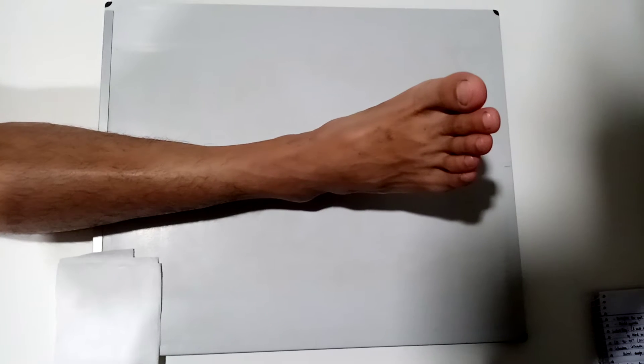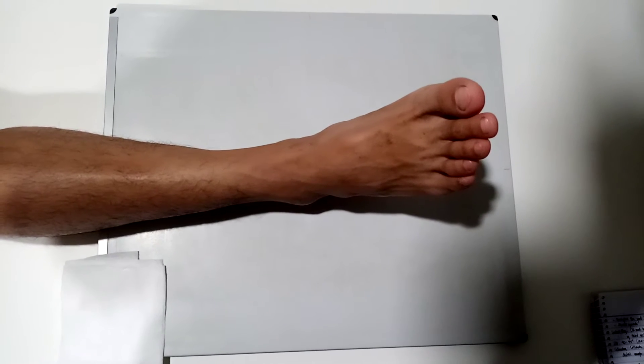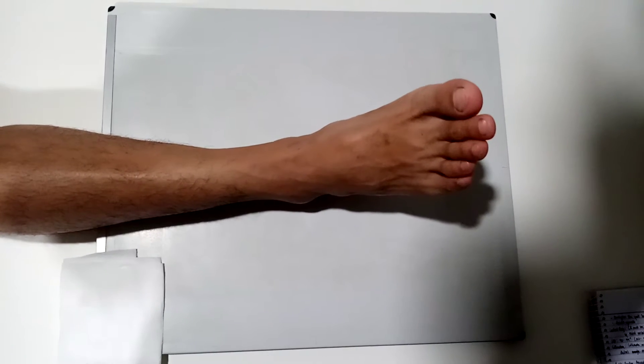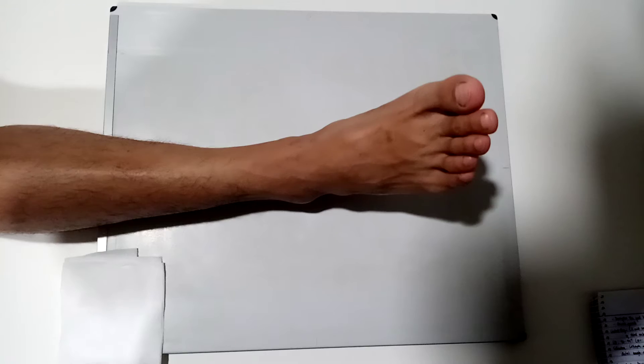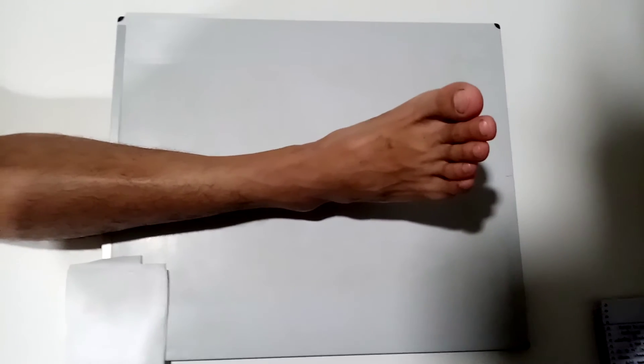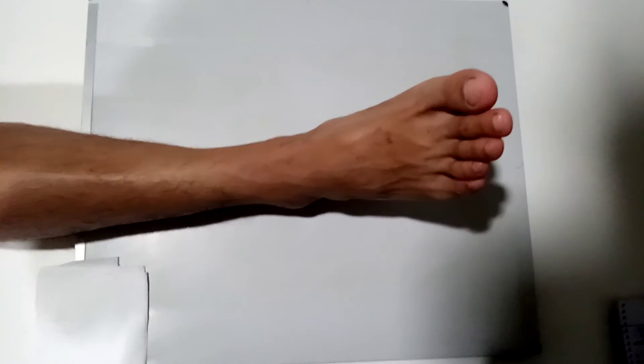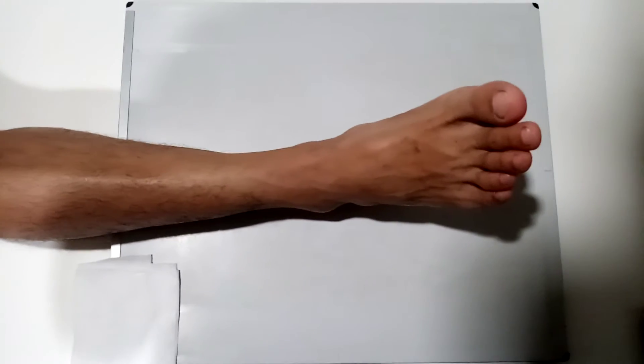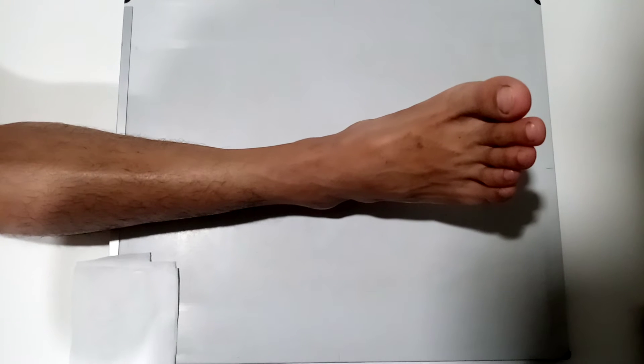This video will demonstrate the ankle routine procedures, namely AP and lateral projections. First is what we're going to demonstrate, the AP procedure of the ankle.